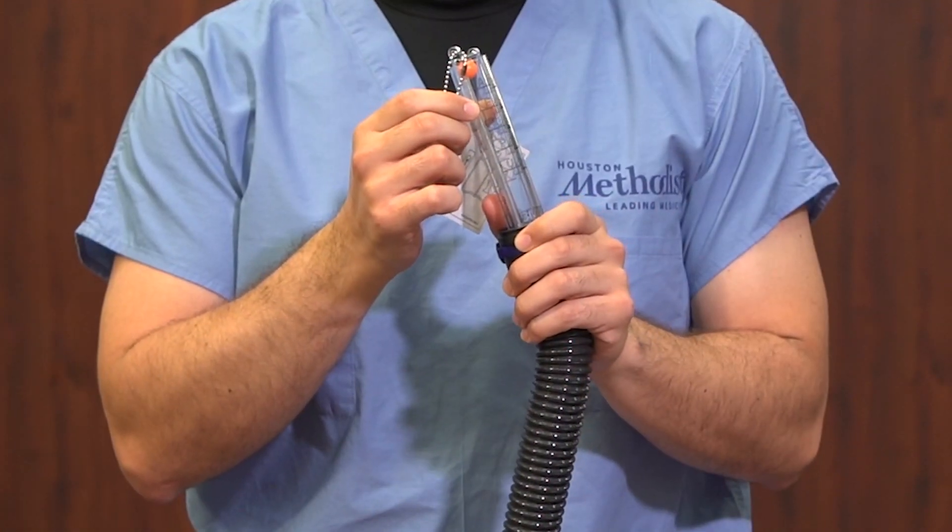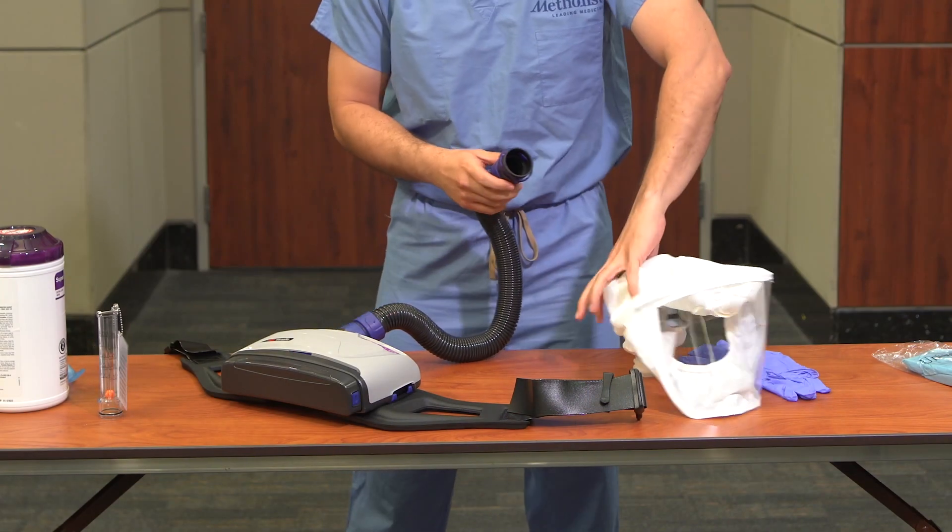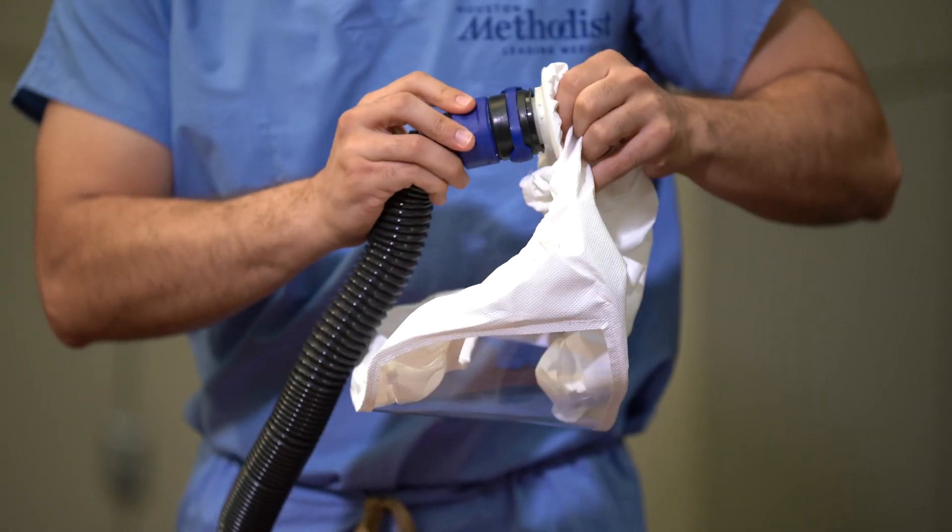Remove the flow meter from the hose and retrieve the head cover from the bag. Attach the hose to the end of the head cover to make ready for donning.